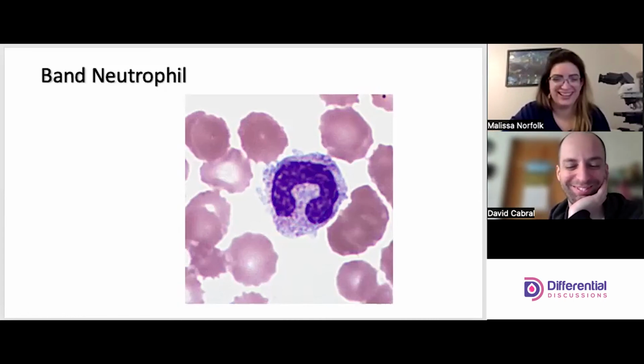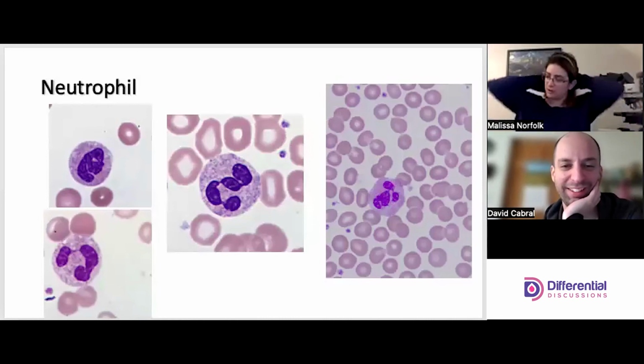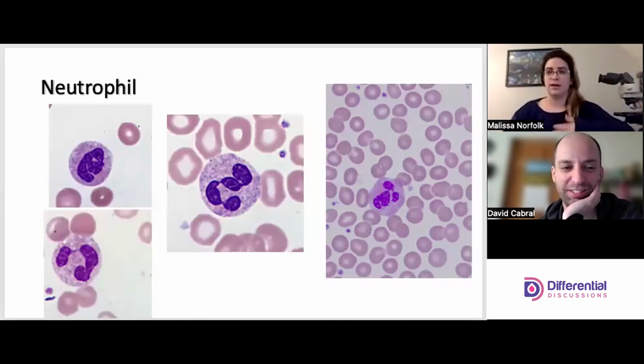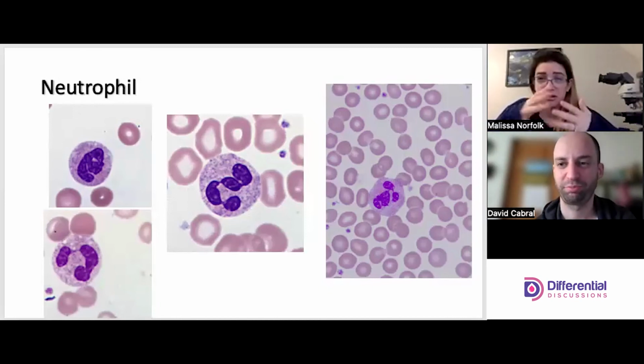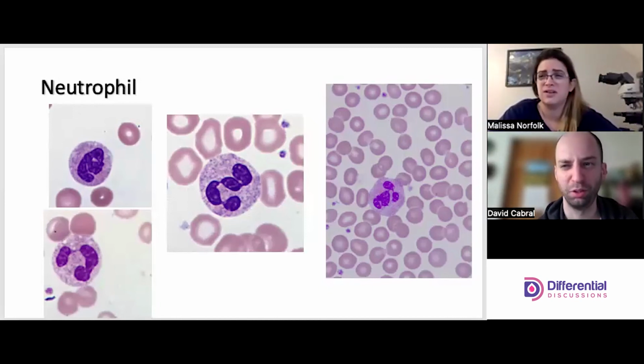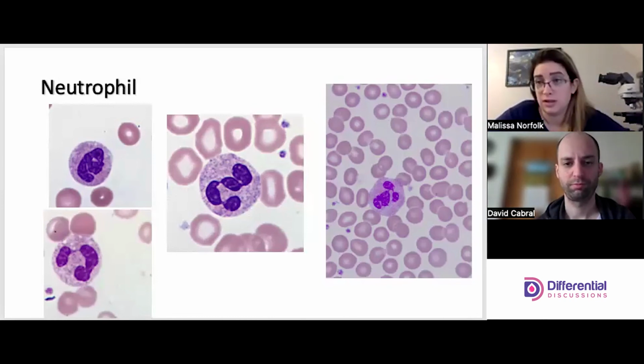All right. And then the last stage is the neutrophil. So similar cytoplasm to what we've seen since the meta, all those primary, secondary, tertiary granules, although it just looks like a pinky color. And remember, if you remove the granules from the cytoplasm, there really isn't a coloration to the cytoplasm. It's just kind of empty, semi-clearness, like a hint of blue or a hint of gray, but there's really no real color to it.